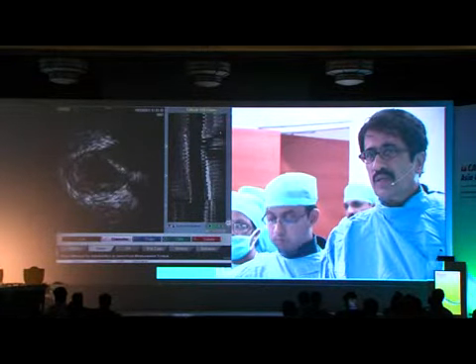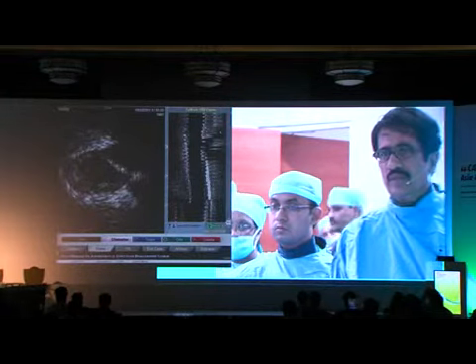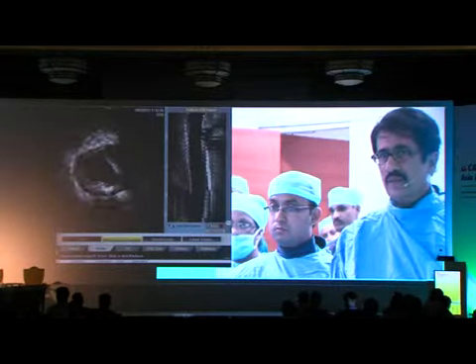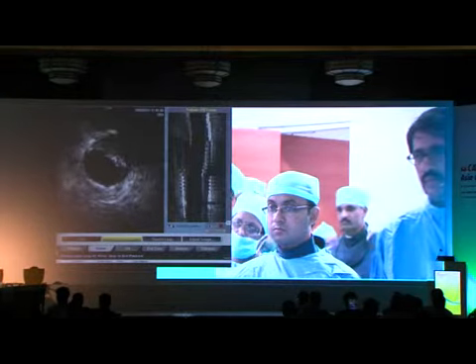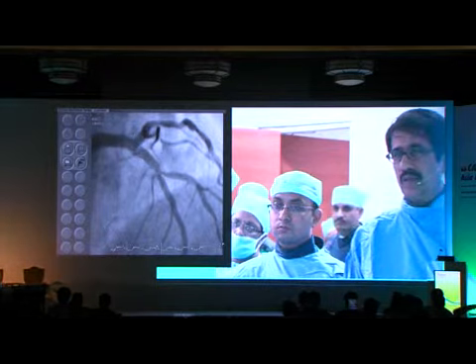And we are actually now doing an IVUS for you. Are you able to see the IVUS? Yeah, before you proceed with the IVUS, in this lesion, what would you favor, an IVUS or an FFR? Shirish, can we see the left anterior oblique view? This lesion of the LAD in LAO is likely to be very eccentric.